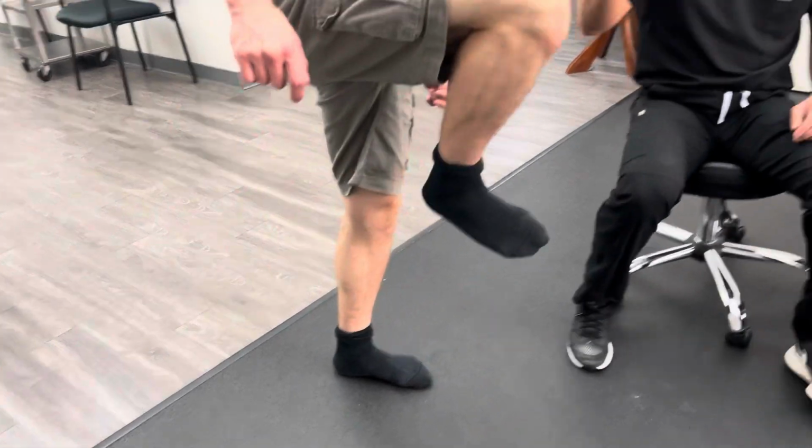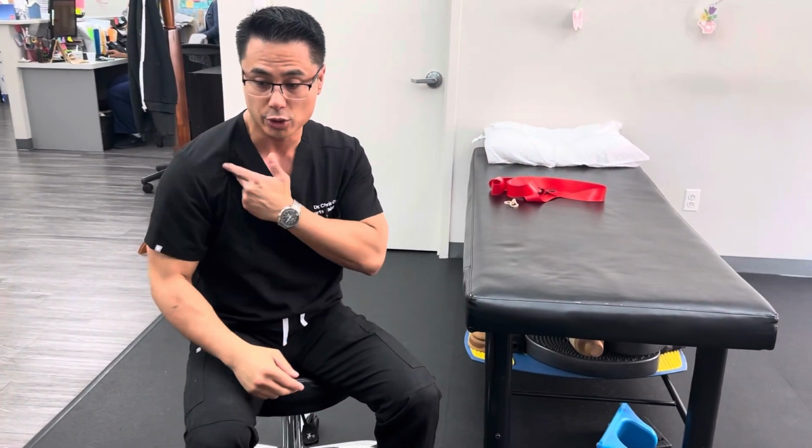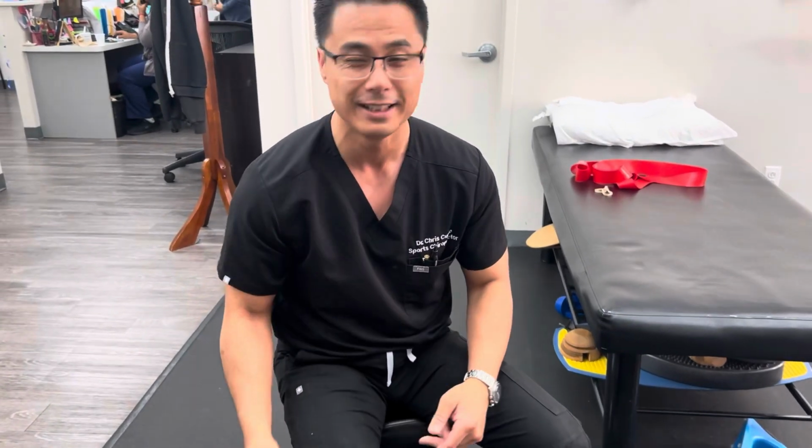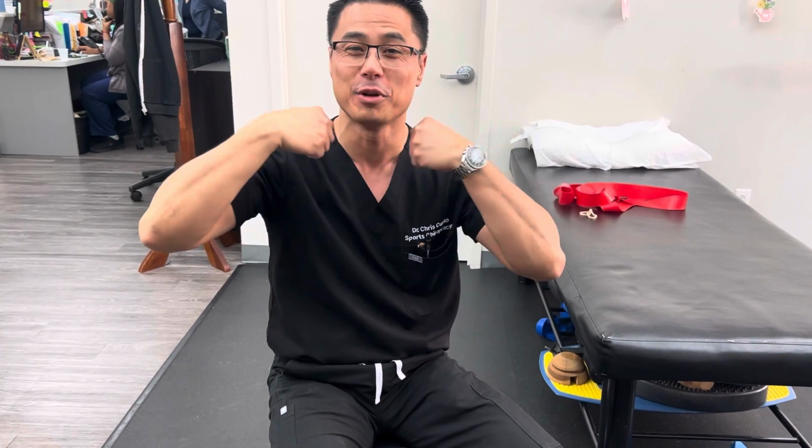All right, so that's basically flossing. We do this a lot with our joints, whether it's elbow, wrist, shoulder, knee, ankle, not the neck, because obviously we do not want to cause any type of choking or asphyxiation to the neck. So that's the only exception there too. So these are a couple of things that we do here.